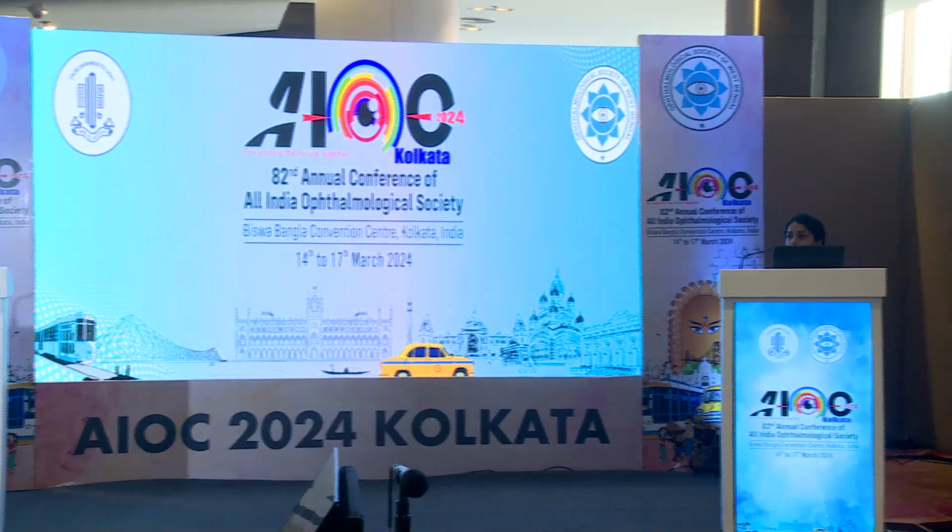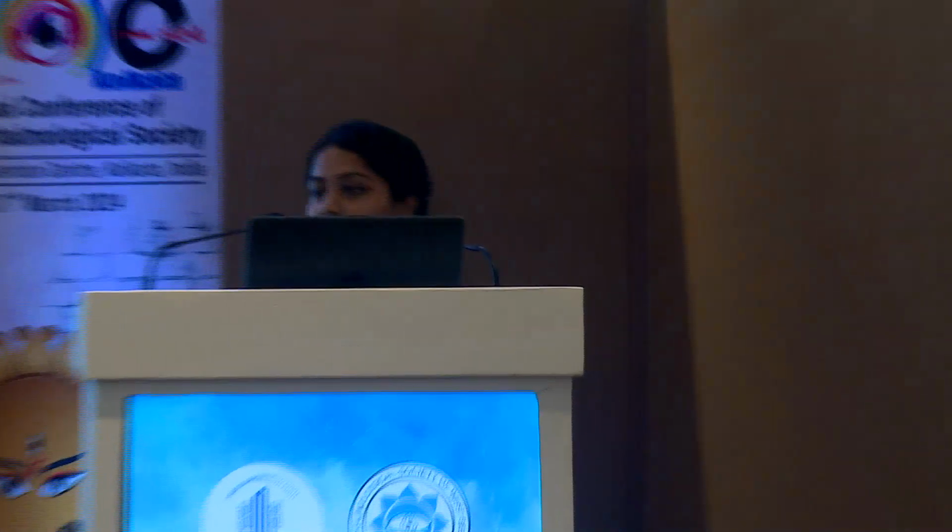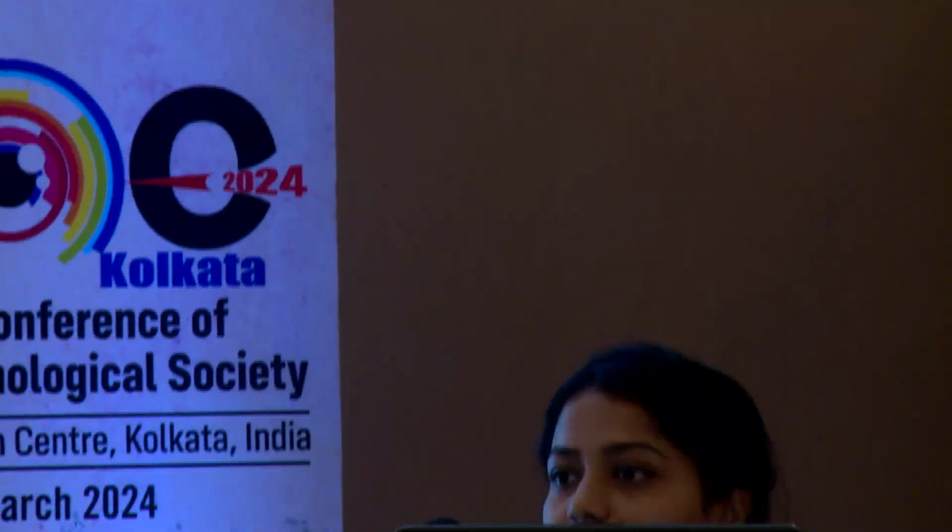This just solves one problem in the clinic, which is should we check the IOL or the biometry when the patient is still dilated, or should we call him another time, when he's undilated. But technically and in real life, I think a difference between a photopic and a scotopic pupil size would have been more relevant for the patient, whether the IOL power changes when a pupil is scotopic versus photopic. If that can be done, it would be more relevant for the patient.